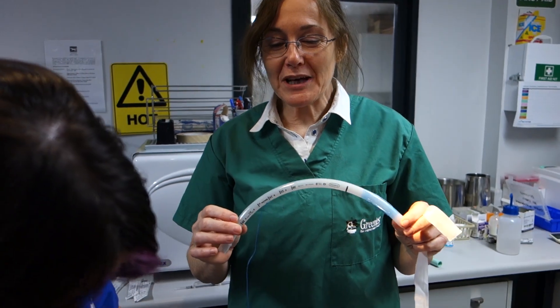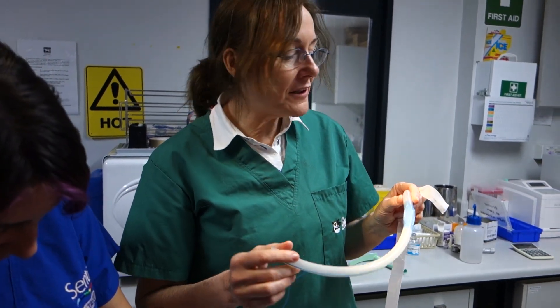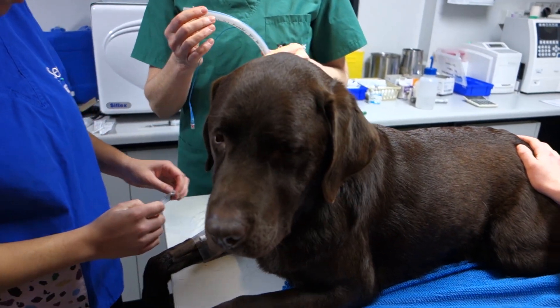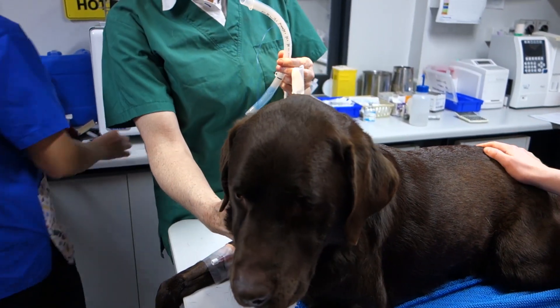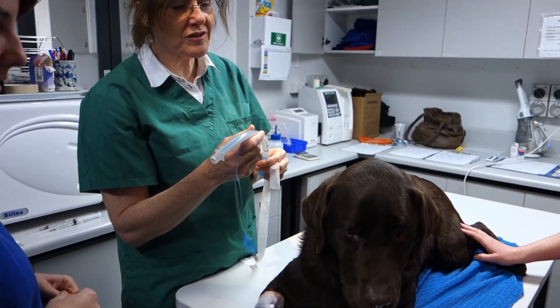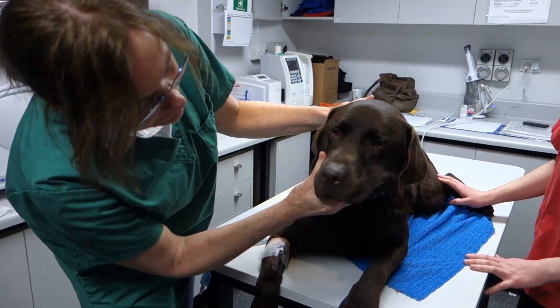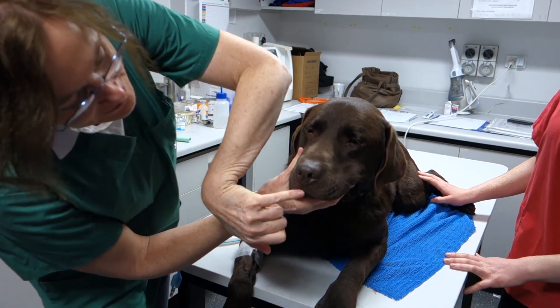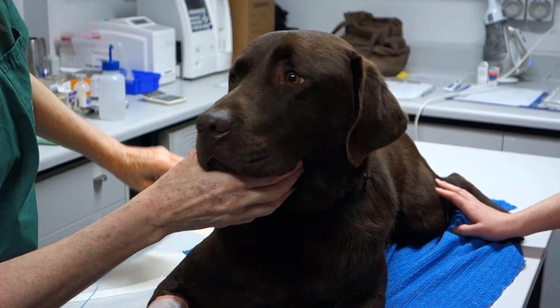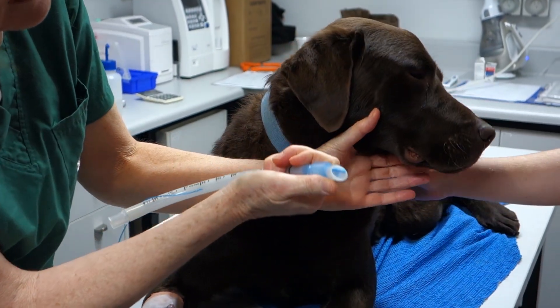So, intubation. Here we have a tube that we have pre-selected for Richie, our Labrador. There are a couple of ways of determining the size of the tube for a dog. You can estimate just if you are able to feel the trachea, the big air pipe, and work out roughly what size. Sometimes in some dogs, if you hold their head up and have a look at their nose, there's a fleshy area that sits just down here underneath the nostrils, and that area can give you a rough idea of the diameter needed for the tube.